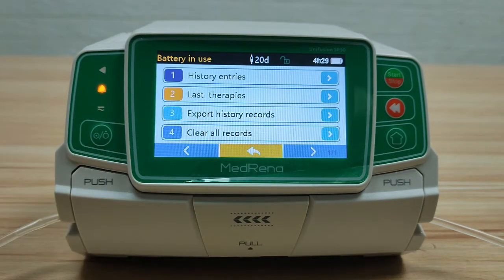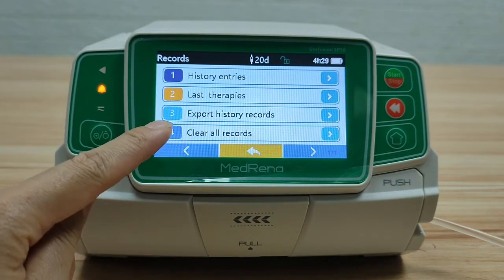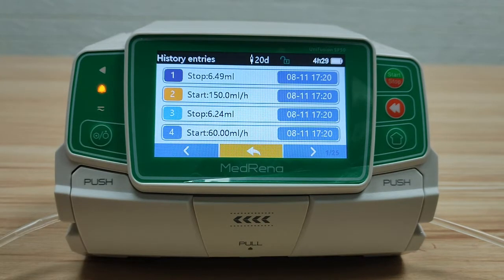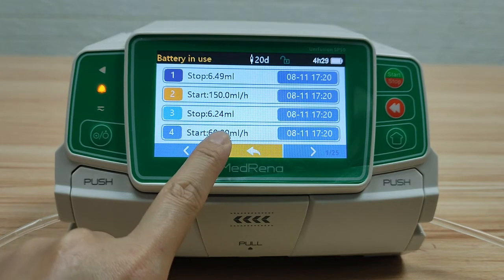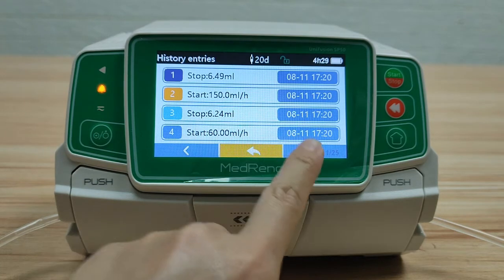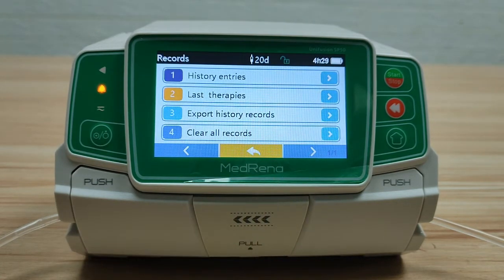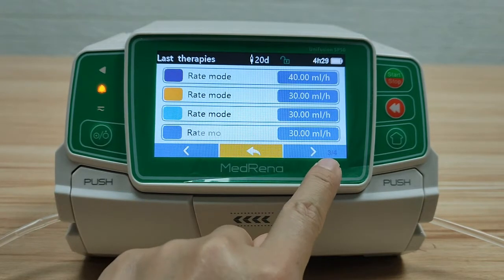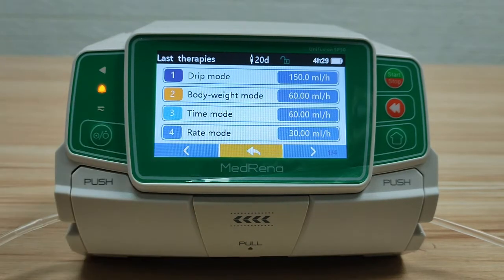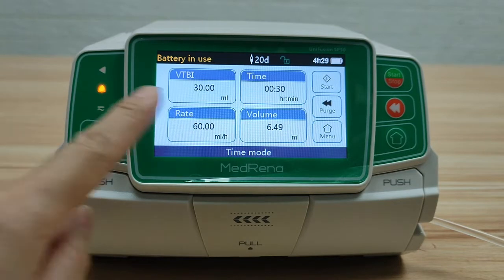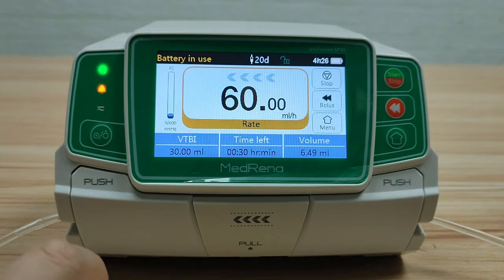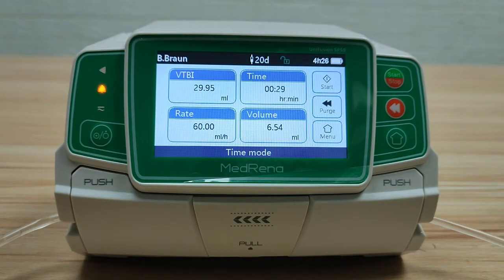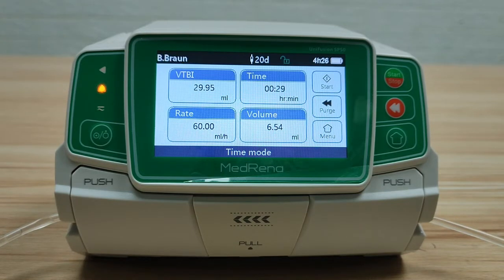Next is Record. There are four items here. First, history entries: the pump can store more than 5,000 records of previous operation data, showing date, time, infusion parameters, and operation details. The data is first-in, first-out. Second, last therapies: the pump can store 20 records of last therapies. Choose either one — it jumps to the screen of the infusion mode with all infusion parameters ready to start infusion. This can save time if users need to apply the same infusion as a previous session.